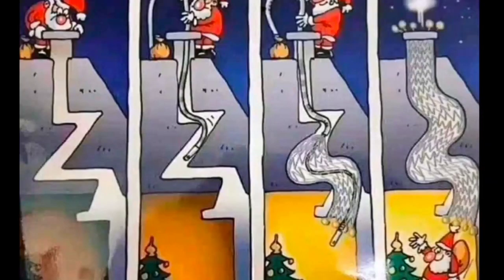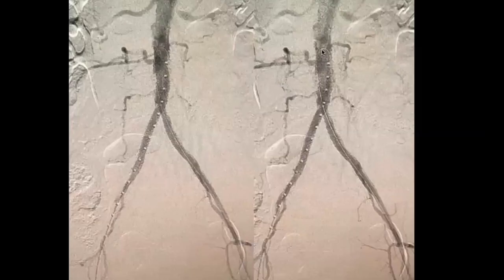Interventional radiologists are very versatile people, and we find our way around twisty bends and manage to fit our way through things. So then this patient ended up having some stents put into the distal aorta and down the common iliac arteries, and now you can see a completely different result.